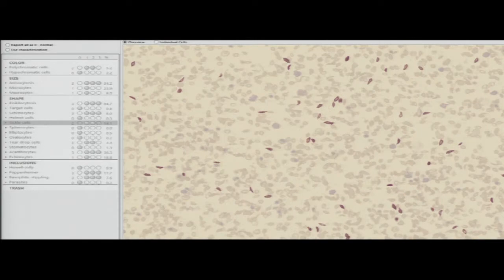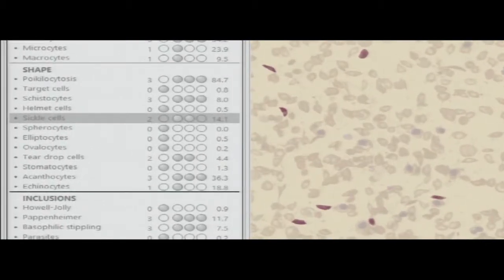I click on sickle cells and it shows all the sickles — 14 percent sickles. So you have a quick way of letting yourself know, and this case had 83 percent HbS.